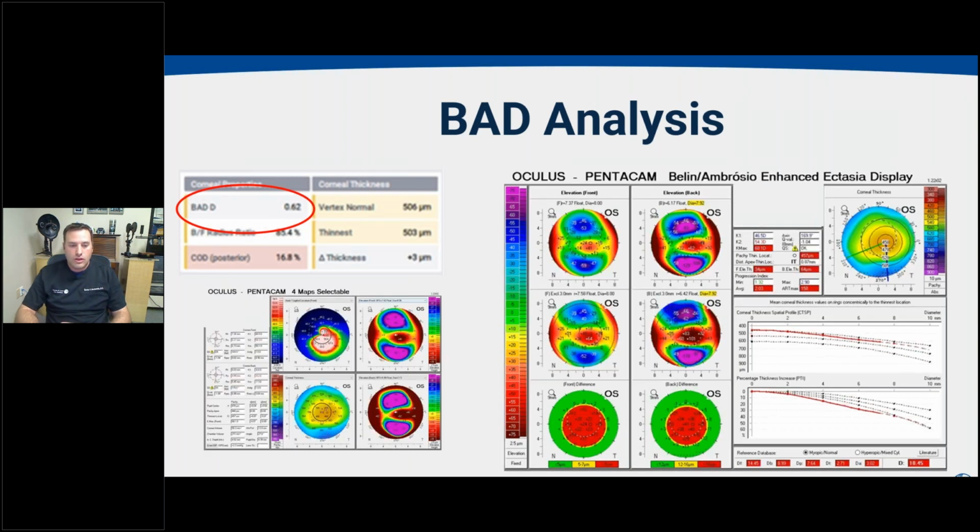And of course, when we get to a truly keratoconic and ectatic cornea, which hopefully we would all recognize by topography, it flags in red, saying this is at least 2 standard deviations out of the norm. And usually if you're seeing a red D score, and the patient has not had any previous refractive surgery, you are looking at a case of keratoconus, and you need to be mindful of that when planning for your IOL calculation. So this is a really nice and quick way, with one value on your full sequence analysis, to flag even an early keratoconus that you might not recognize immediately, even just with anterior topography that is available on other devices.